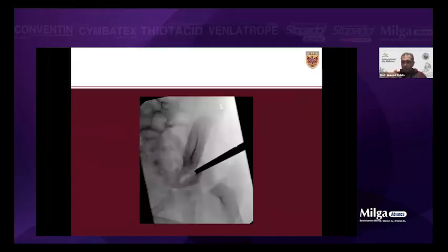After you complete your cut, I use the osteotome to stretch it slowly. I don't do Salter anymore, Dr. Ahmed, although our neighbors in Toronto still like to do Salter because this is his home. So I go with the osteotome, I go down, and then I replace it with the lamina spreader. There are too many types of lamina spreader. Try to get the non-toothed lamina spreader so you won't crush the bone, and go very, very gently and be very careful.